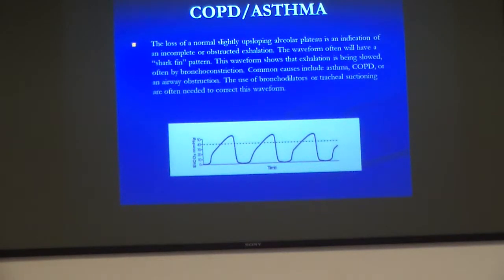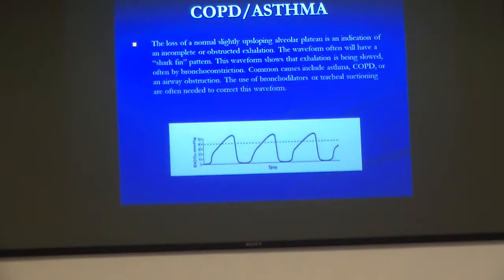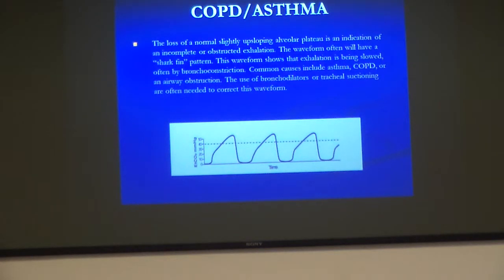So obviously, you're looking at waveforms, but you're looking at your patient too, and I think that's the thing. We can get all worried and tied up with waveforms with end-tidal CO2, but how's your patient look? You can tell. Are they working hard to breathe? Are they slowing down because they're pooping out and they need to be intubated? Are they slowing down because you've now used your bronchodilators and they're getting better? So it's all about assessment too. This is an assessment tool that we use, but at the end of the day, we still gotta listen to breath sounds and do an assessment on our patients.